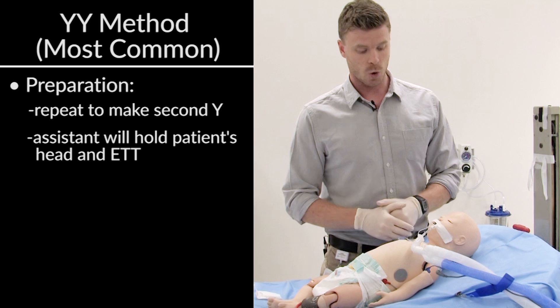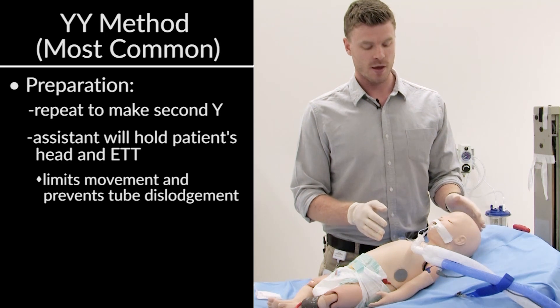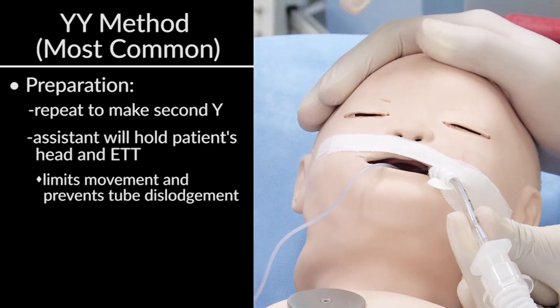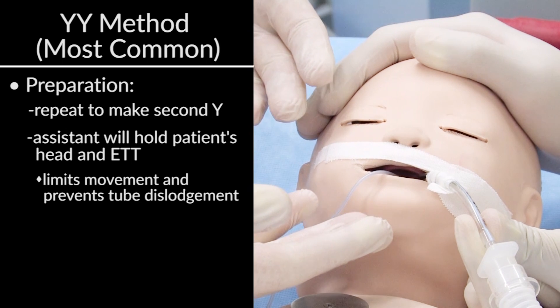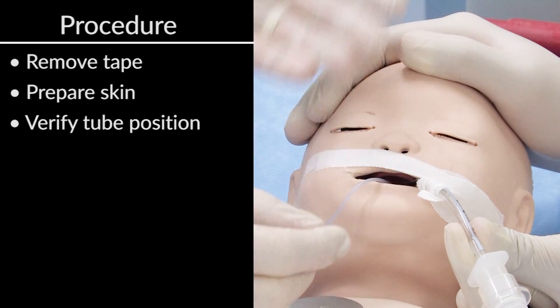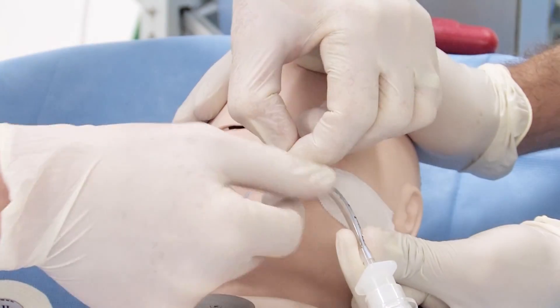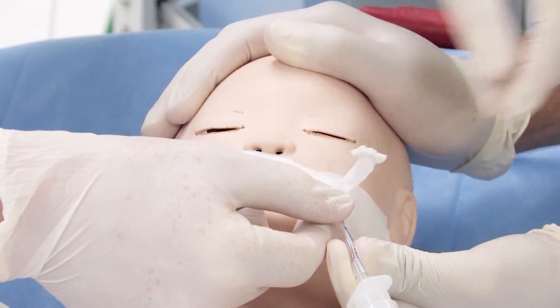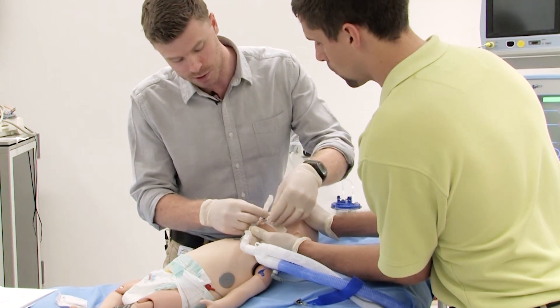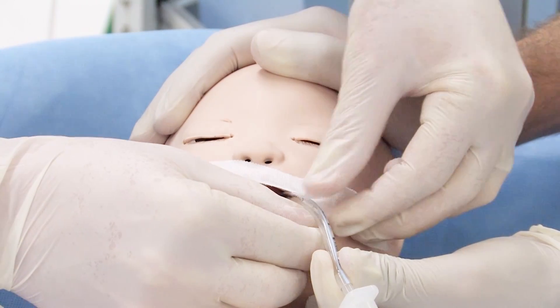We're going to have an assistant come in here and hold the baby's head and the endotracheal tube. Holding the head and the endotracheal tube ensures that if there are any patient movements, they'll be able to make sure the tube doesn't come dislodged. We've verified the placement — it's in good place — so we're going to tape this endotracheal tube right in the same position it is now. I'm going to take off this tape job, prepare the skin, verify the position, and then do the tape job. Good communication is key between the person doing the re-taping and the person assisting, so I'm going to make sure my assistant knows he has total control of the endotracheal tube now because the tape is off the face.